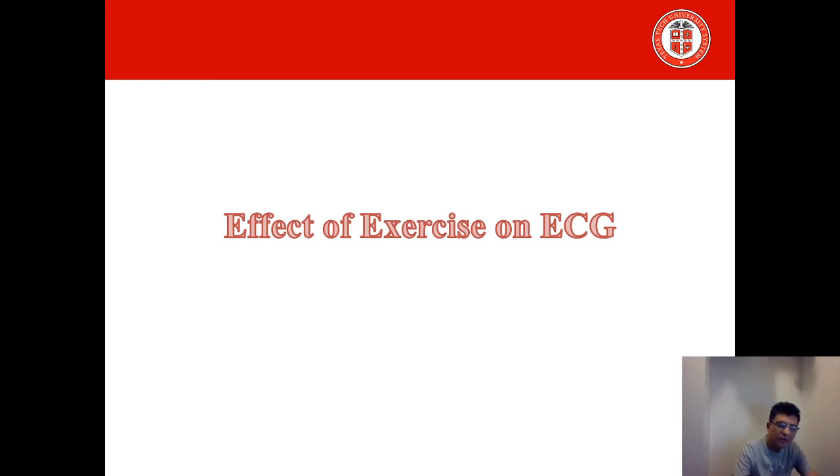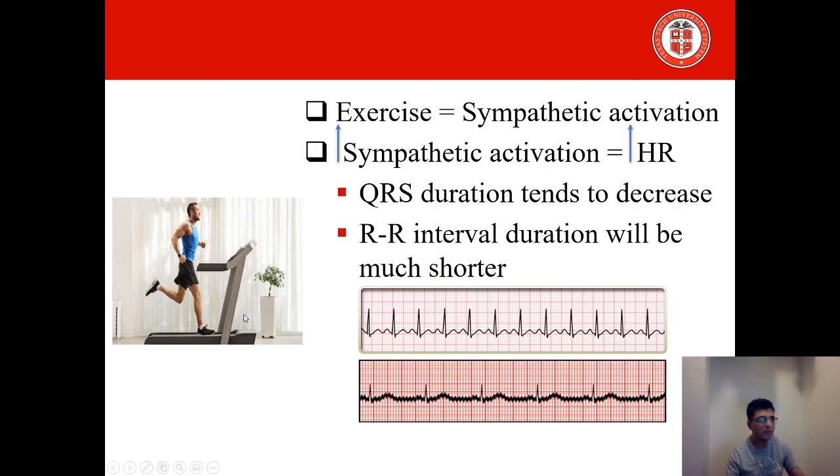Now, we are almost done with the ECG lead placement and the recording of a normal ECG. Now, let's move on to see the effect of exercise and a few pathological conditions on ECG and how the ECG changes. This is very simple.